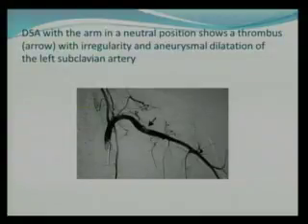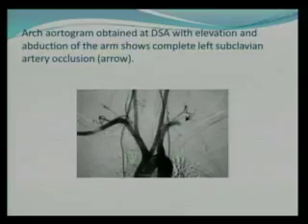Patient goes home. Over time, because the compression is not relieved, the stent will get degraded. There'll be wear and tear of that stent every time the patient picks up her hand. And who knows, there could be a pseudoaneurysm, there could be a stent rupture. So you've got worse things lined up down the line. So this is where you're talking about left subclavian.